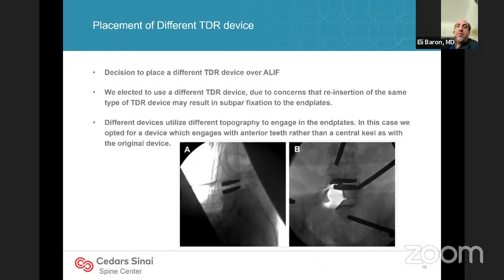The problem is every time I took a suture ventrally, I would hit the polyethylene core. The properties of a disc replacement when it's very far back in the spinal canal with a very ventral hole didn't let me put a needle in there because it would literally hit the core. And there was actually a spigot of bone that didn't let me cinch down a knot. It would literally deflect the metal. So we put it in there, but I thought the knot wasn't optimal.